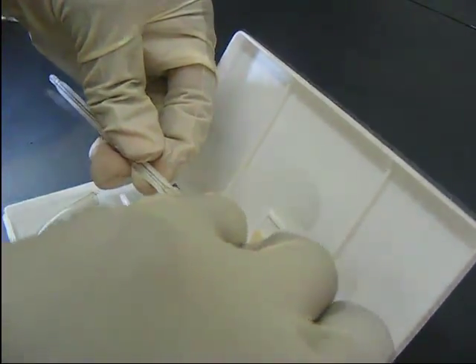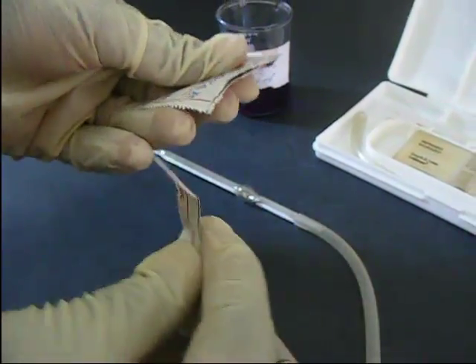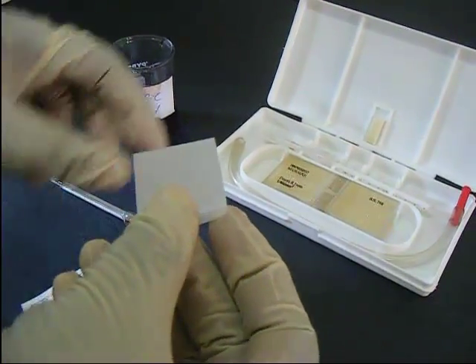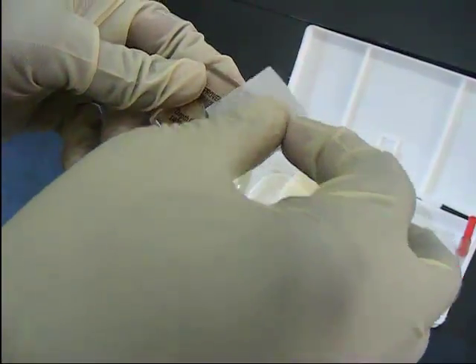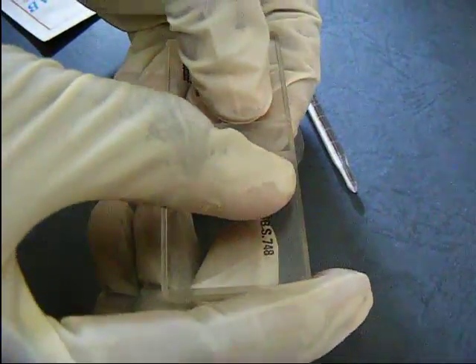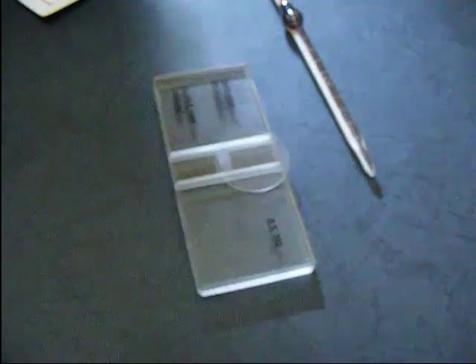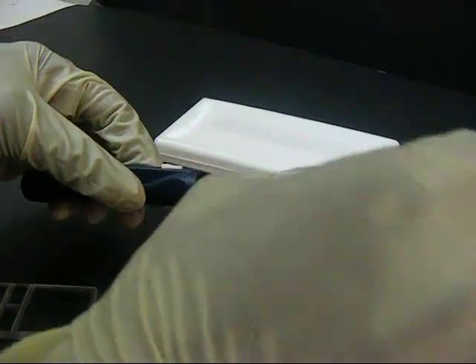A plastic tube for pipetting is attached to the white cell pipette and made ready for use. The counting area and the cover slip are both wiped with a clean alcohol swab. The cover slip is placed firmly on the counting chamber. The lancet is then fixed on the lancet holder and made ready for use.